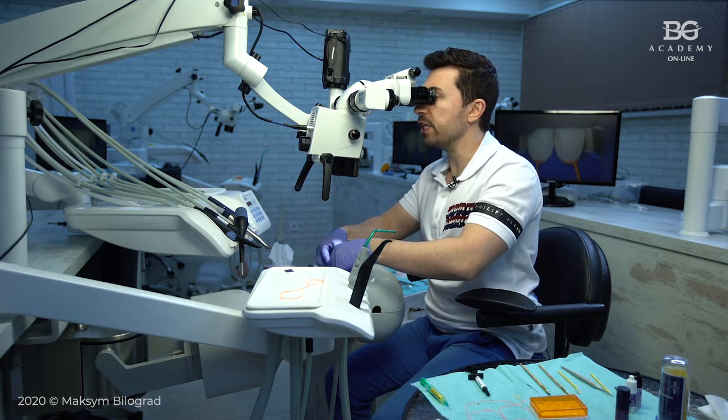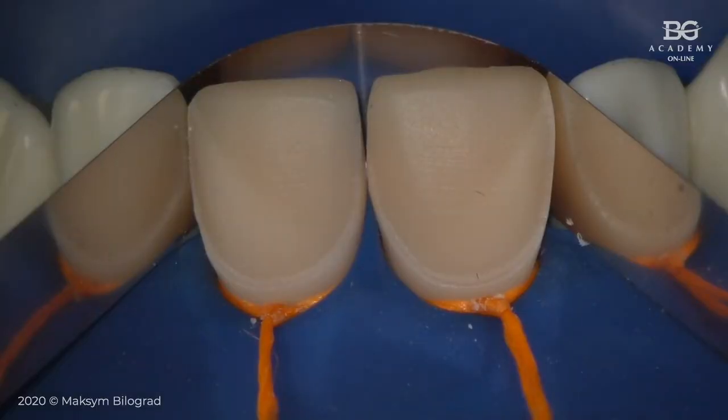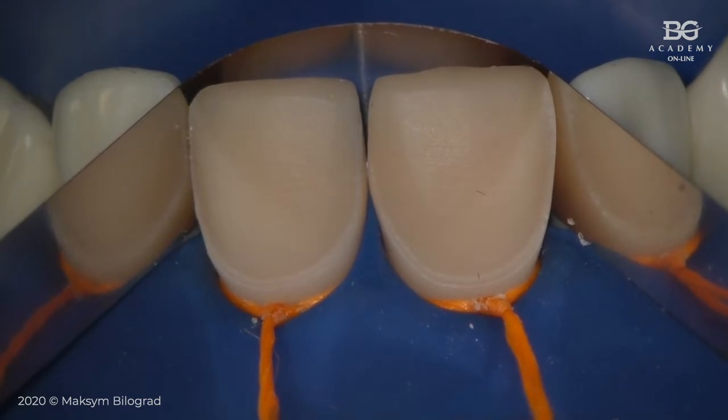To protect adjacent teeth, I'm using metal band, metal strip, okay, metal strip, because Teflon will not protect them, but metal will. And I will take my sandblaster, intraoral sandblaster. I will use aluminum oxide 23-27 microns, okay, with water. So I'll put some suction and we'll do some sandblasting.